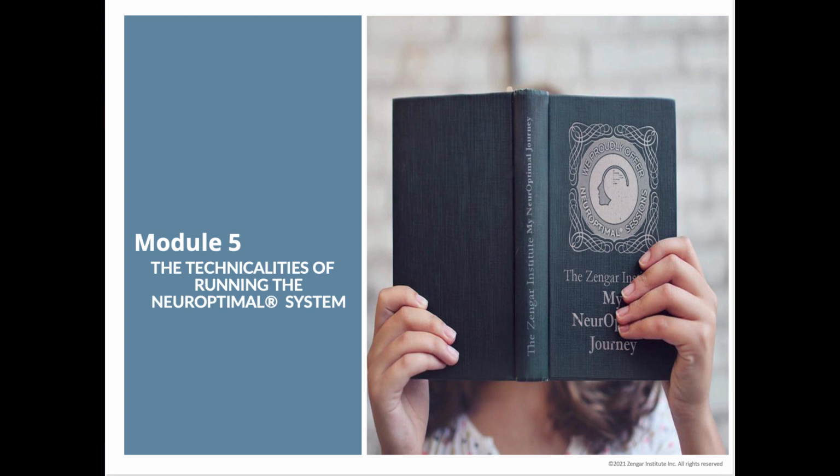So we're going to talk now about really how to run the system. So much of it is so easy to run. Hook them up, put the sensors on, press the button, or double tap the name. We'll talk about different ways to get it started, but I'll give you some deeper insight into some other things that are going on.